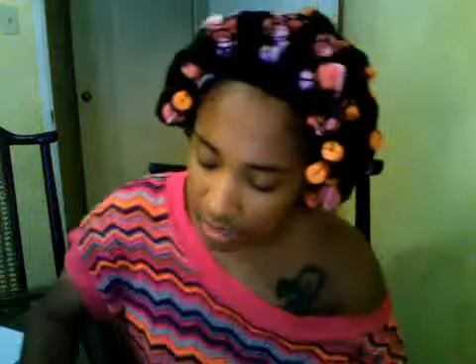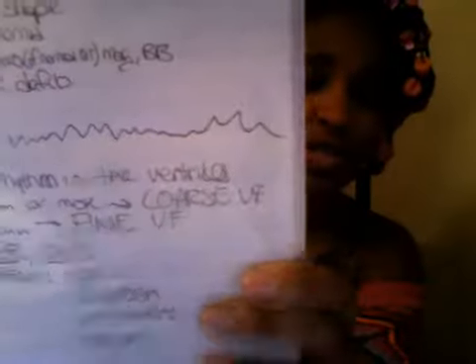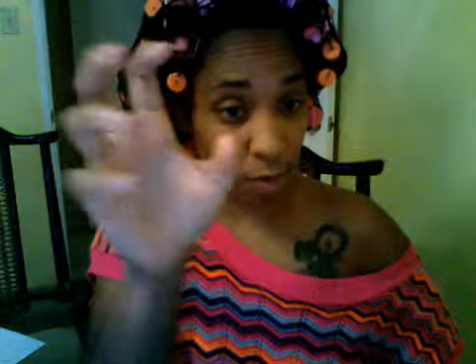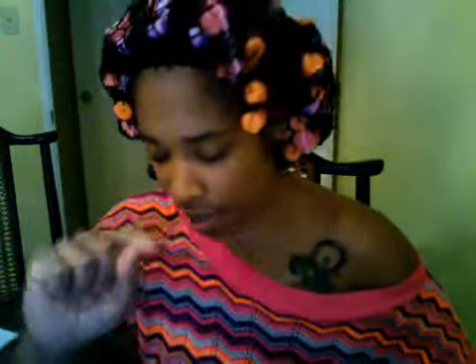Okay. Ventricular fibrillation is similar to VTach, but it's a little bit more narrow. It looks more like this. These are easy to draw because they're pretty simple. That's considered the chaotic rhythm within the ventricles. This is like where you have AFib, where you have VFib, where your ventricles are fibrillating, just like that. If it's 3 millimeters or more, it's coarse VF. If it's less than 3 millimeters, it's fine VF.